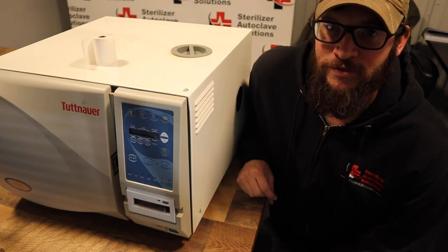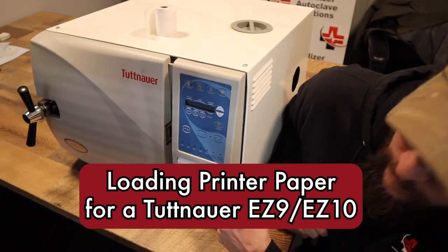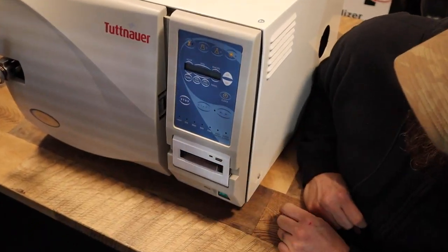Hi, this is Ian with Sterilizer Autoclave Solutions. Today we are looking at the EZ10, and as we can tell, there is no paper in here, and we are going to reload the paper.